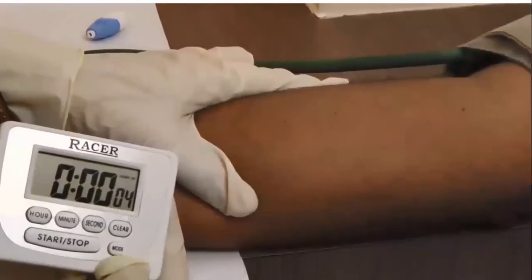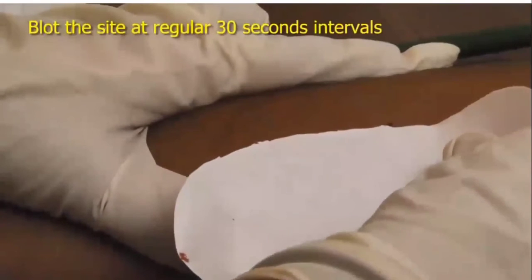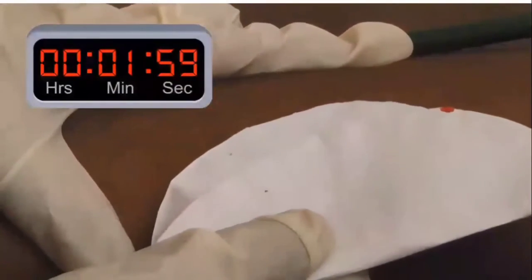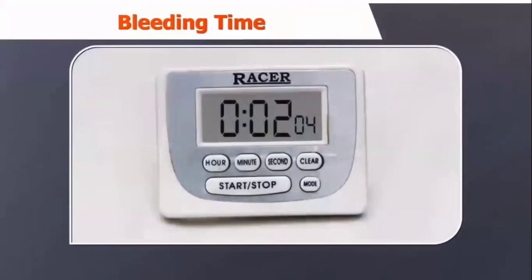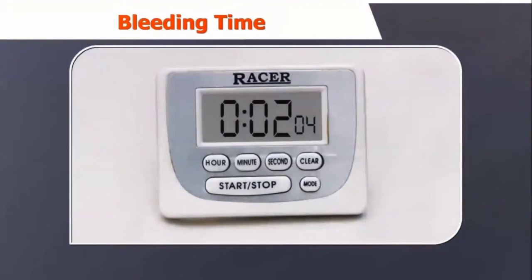The blood drops are wiped with the filter paper after every 30 seconds. As soon as the bleeding starts, the stopwatch is also started. The edges of the blood drops are wiped with the filter paper until the blood completely stops. When the blood no longer appears on the filter paper, the stopwatch is stopped and the time is noted. That time will be the bleeding time for that person.